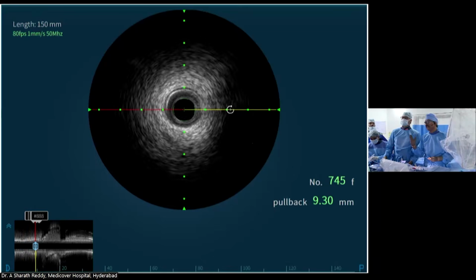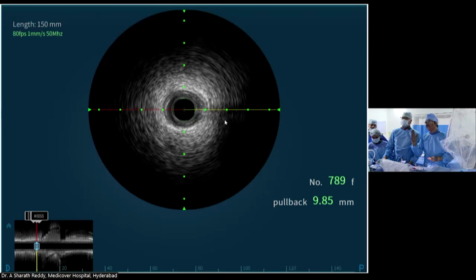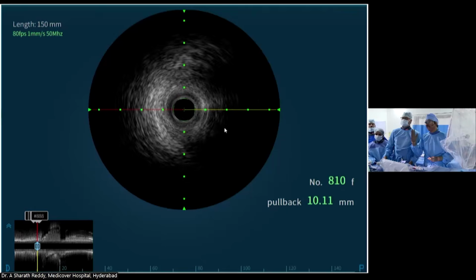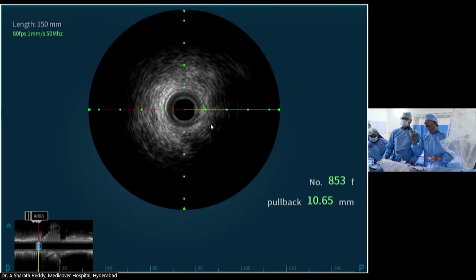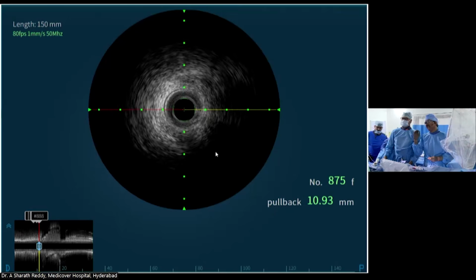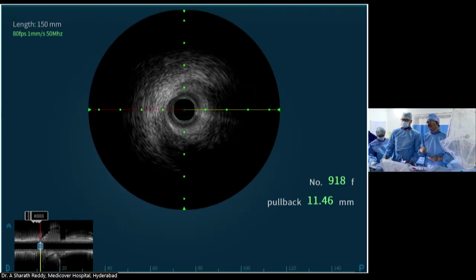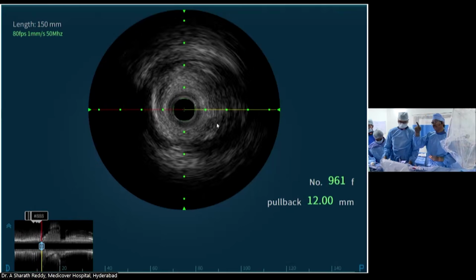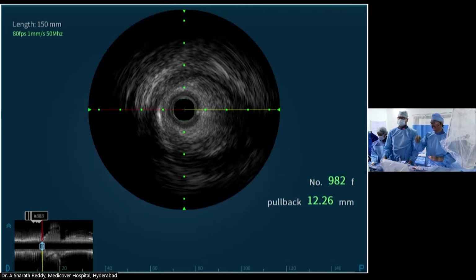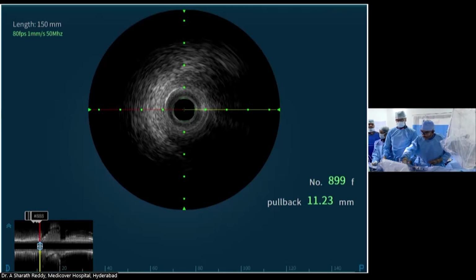You can see here at 3 to 6 o'clock a vessel coming and joining. It's okay, but it's not gradual, and you can also see the branch which is coming and joining is also in the same direction. So that was the problem I had.